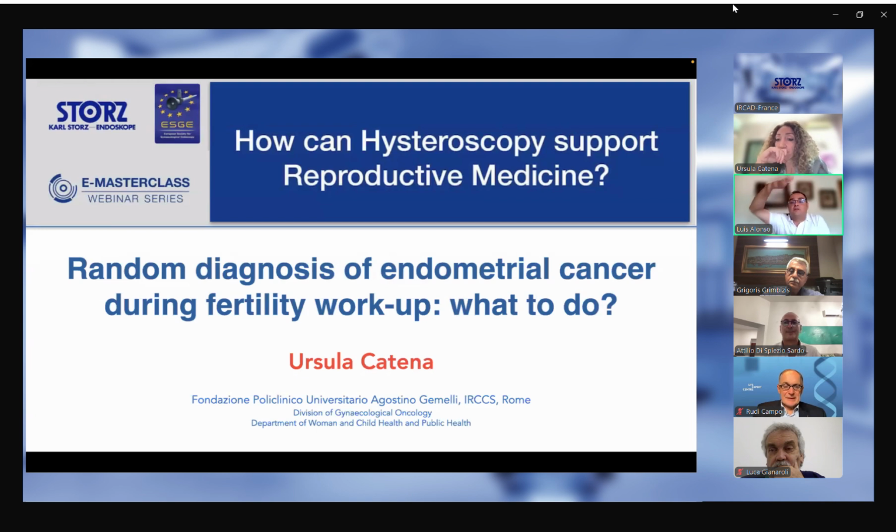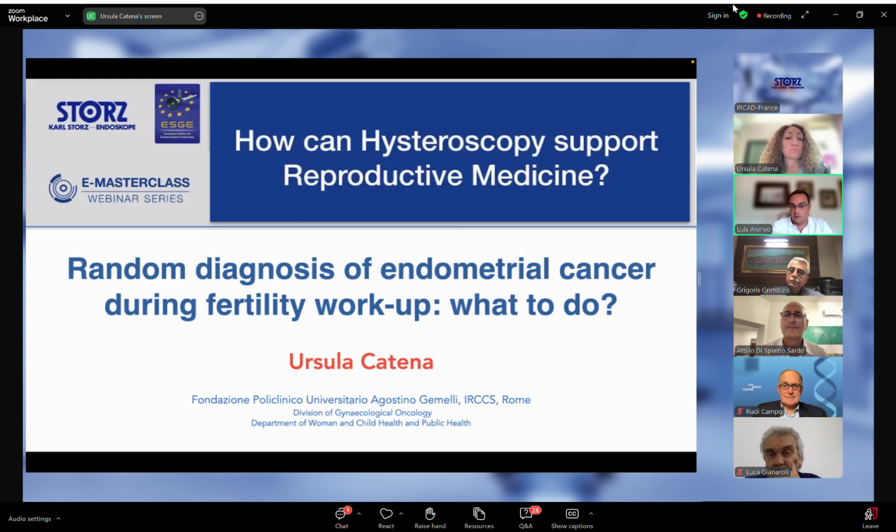But the truth is that it is in contact, and the blood that is kept in the niche is touching the posterior wall. So there is some inflammation in that area. What they want to do with this 360-degree technique is to remove that inflammatory tissue in some way. Instead of cutting or removing with a loop, what they do is a fulguration with a 1 millimeter depth only. So we take away that inflammatory tissue, and the aim is that the next tissue that will grow next month is a normal one without that inflammation.